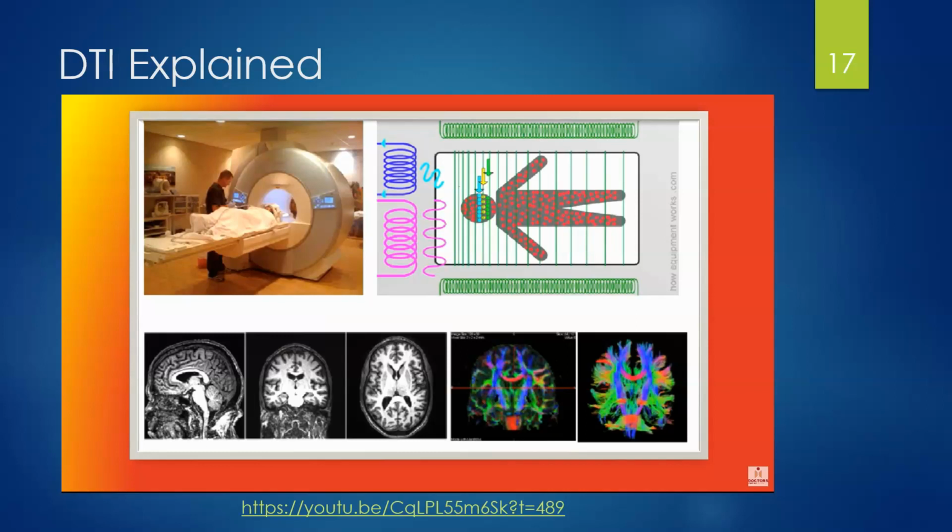So the procedure is as follows. Naturally, we put the patient in the MRI machine and we scan. In the scan, we'll get routine MRI studies that produce these black and white pictures, the three on the left. But in addition, we're going to do DTI studies that produce tractography, which we don't use for interpretation, but that's what gives us our data that we will analyze. So again, we have three pictures on the left and the tractography on the right, which we then evaluate the data.